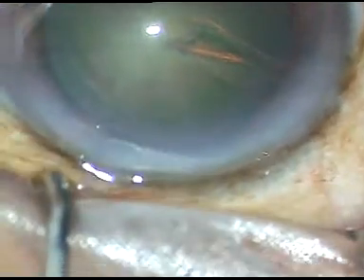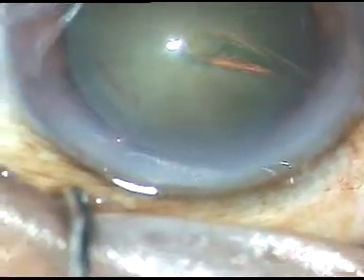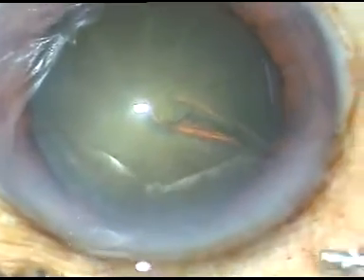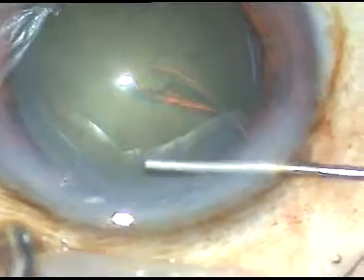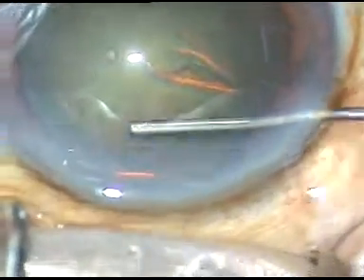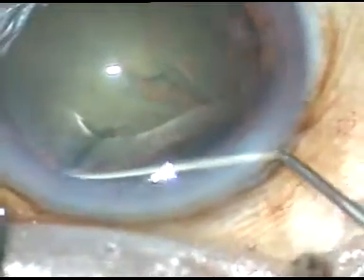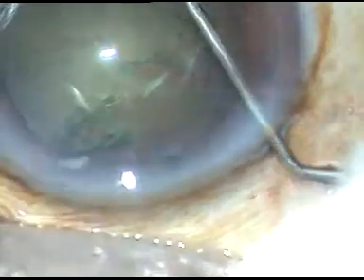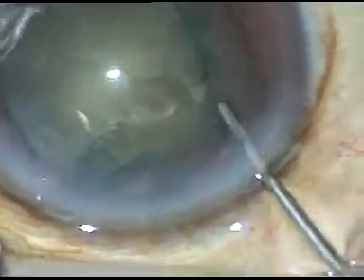The rhexis is made. This is a fairly round capsulorhexis. Now hydrodissection is done. Fluid wave is burst underneath the anterior capsular rim. It goes to the other side behind the nucleus. Tap the nucleus and rotate the nucleus.